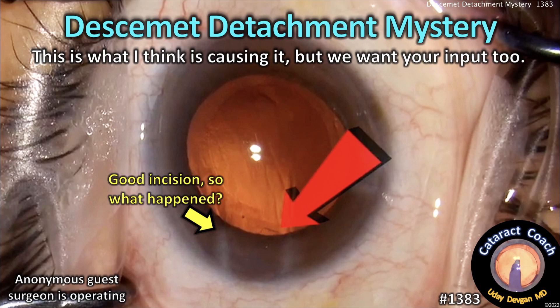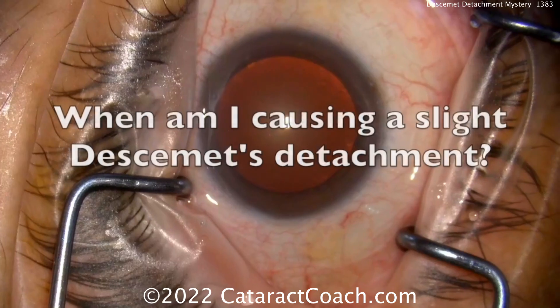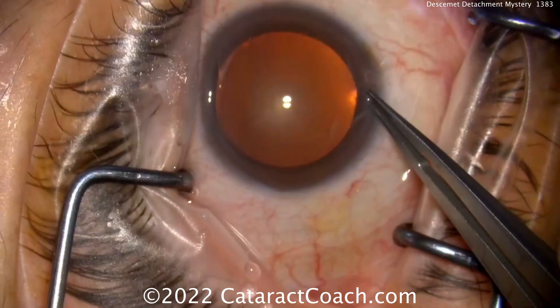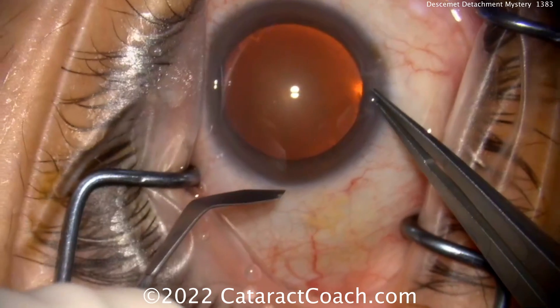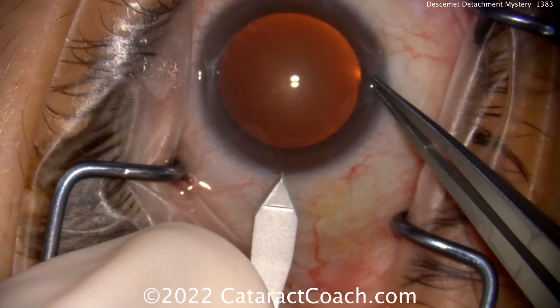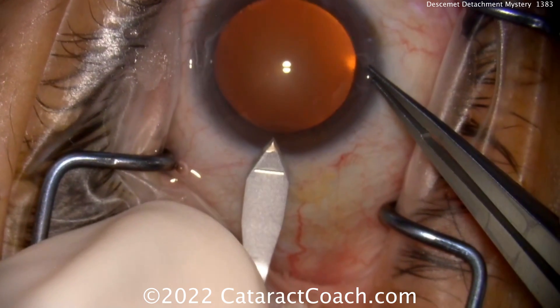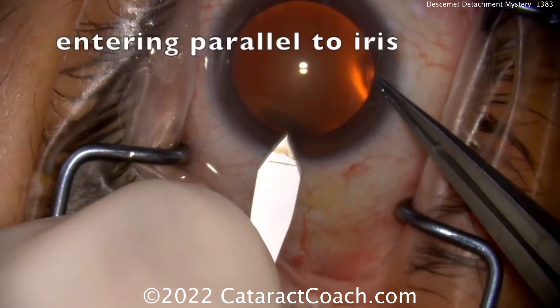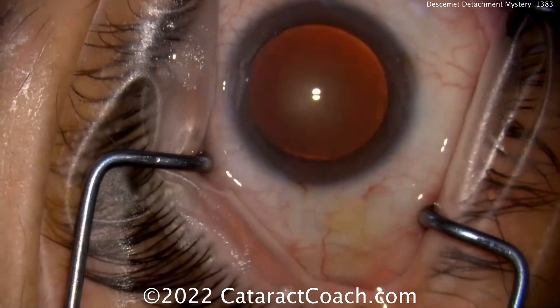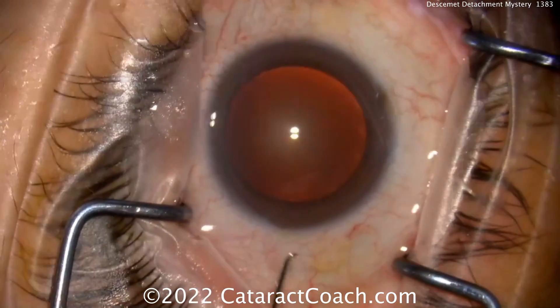At cataractcoach.com, we're investigating what causes Descemet's detachment — but we want your input too. An anonymous surgeon sent us this video and asked: when am I causing a slight Descemet's detachment? This is an experienced surgeon with nice draping. Let's watch the main incision carefully — it's a good approach with a good angle and a two-plane approach. The tunnel length looks pretty good — no issues there.